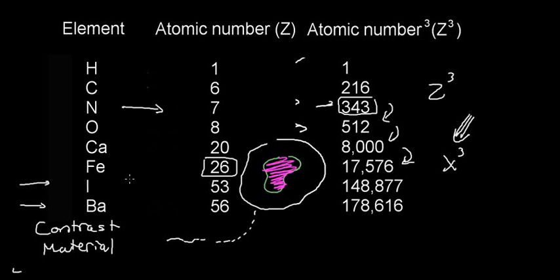So anything that has a greater concentration of iodine is going to stand out considerably. And that is why this is called contrast material. I can inject it. It's going to migrate to a sort of tissue, gets absorbed there, and then that tissue is going to exhibit a high contrast. I'm going to see it very clearly. And just so you know, we can use barium as barium sulfate. We can use it to look into gastrointestinal absorption.